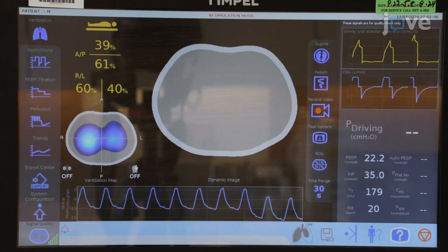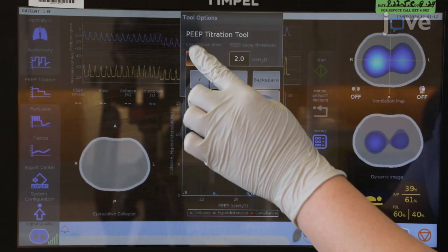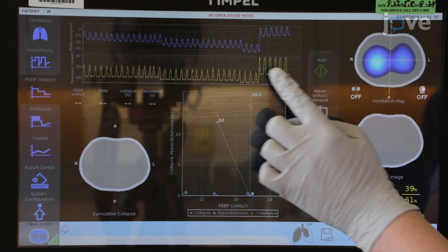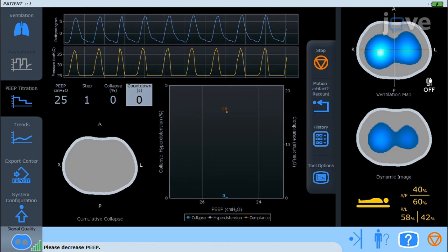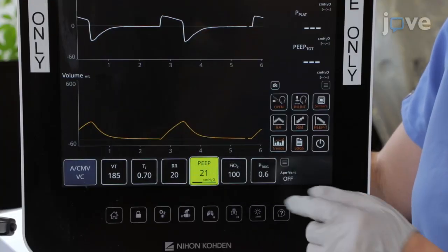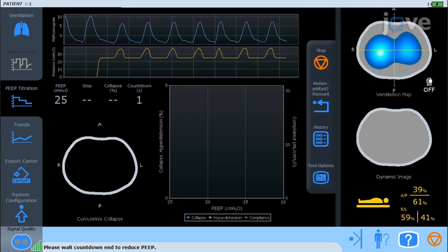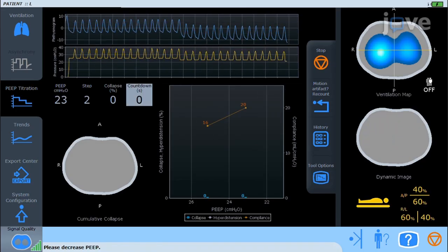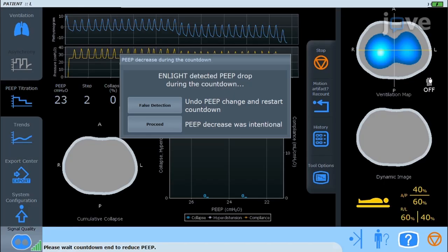Select the PEEP titration tool from the main screen icon and access the tool options. Set time intervals for PEEP changes during titration to stabilize ventilation in each condition. Adjust the threshold value for automatic PEEP change detection. Press Start on the PEEP titration screen to initiate the countdown based on the adjusted time for PEEP changes. When prompted, adjust the PEEP value on the ventilator according to the protocol. The device will automatically detect the change and start a new countdown. Monitor the PEEP changes and if automatic detection fails, manually stop and comment on the procedure.